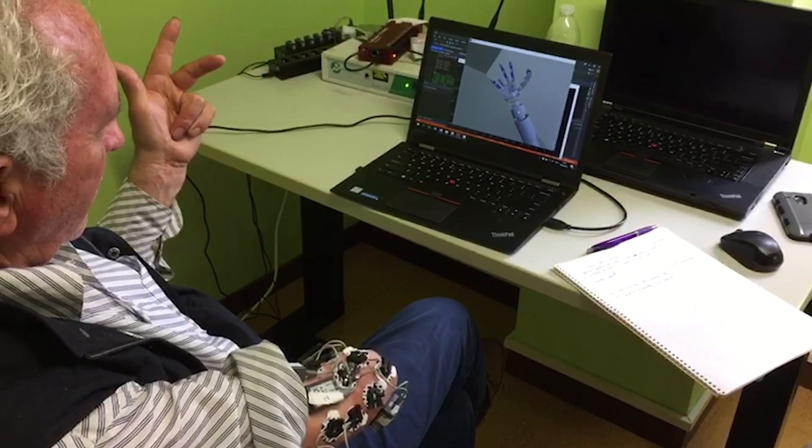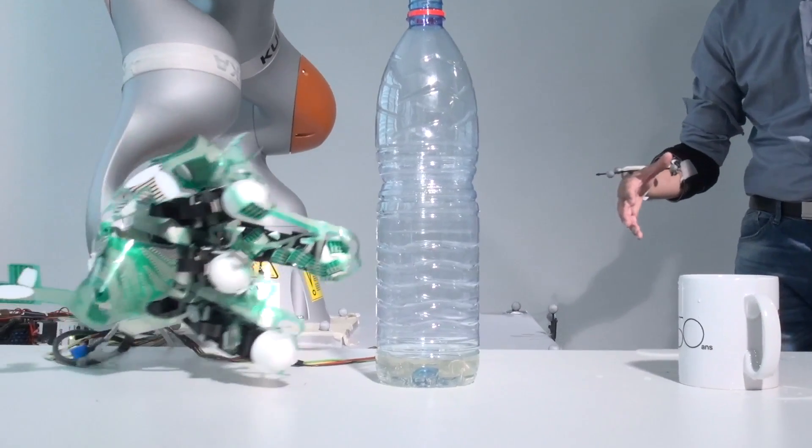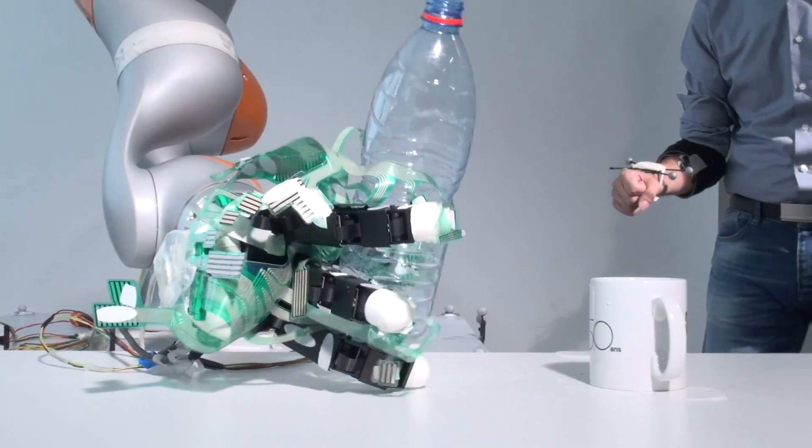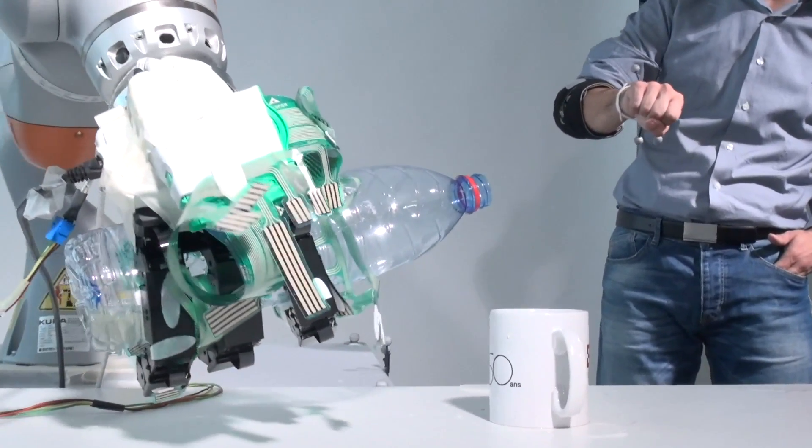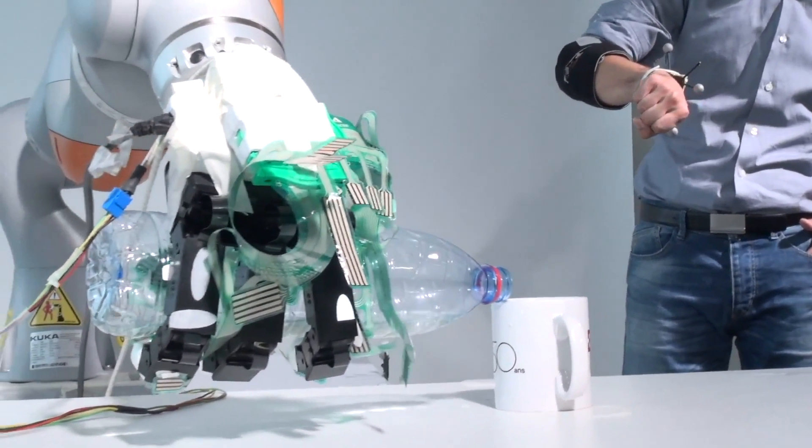On top of that, because these predictions of the finger movements may not be 100% accurate, we have this robotic automation which allows the hand to automatically start closing around an object once contact is made.